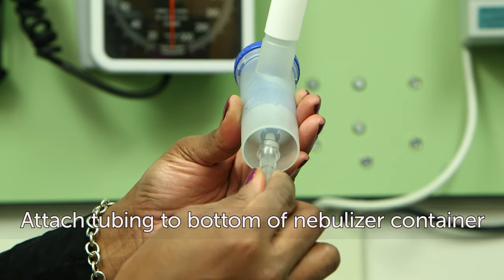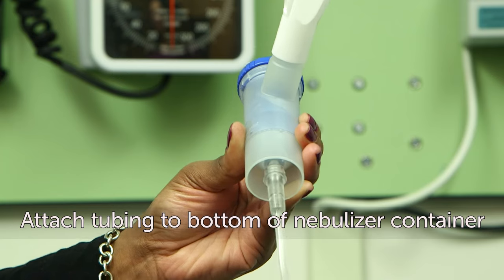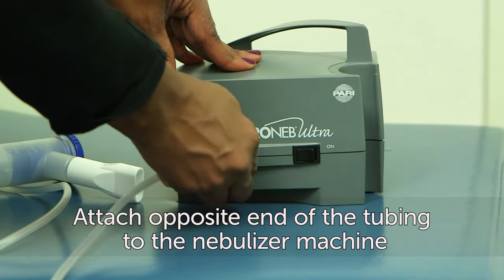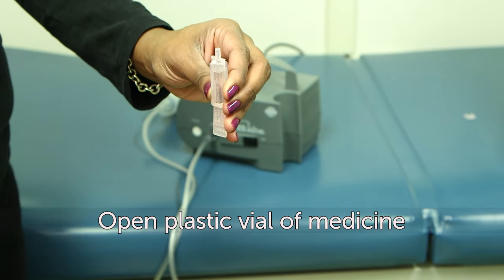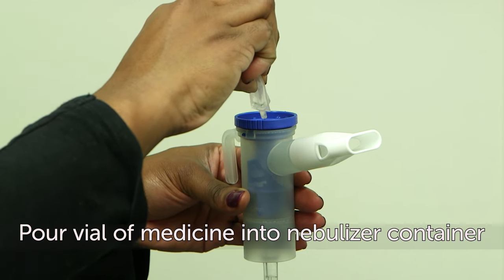Then attach one end of the tubing to the bottom of the nebulizer container. Attach the other end of the tubing to the nebulizer machine. Next, open the plastic vial of medicine and pour it into the nebulizer container.